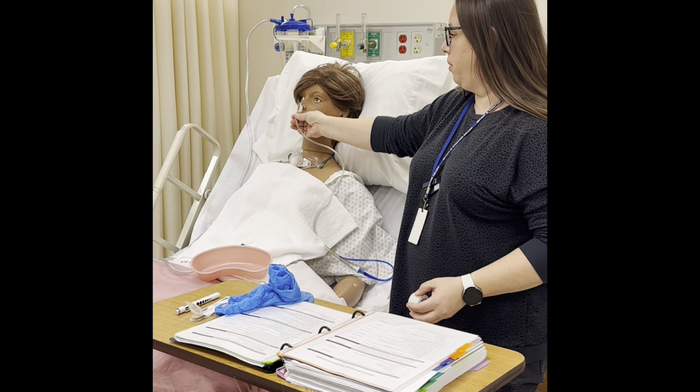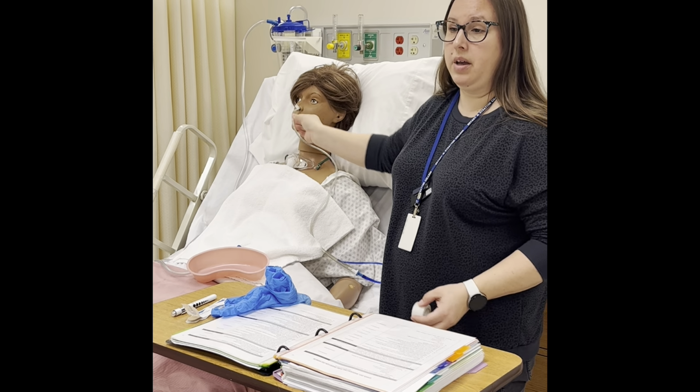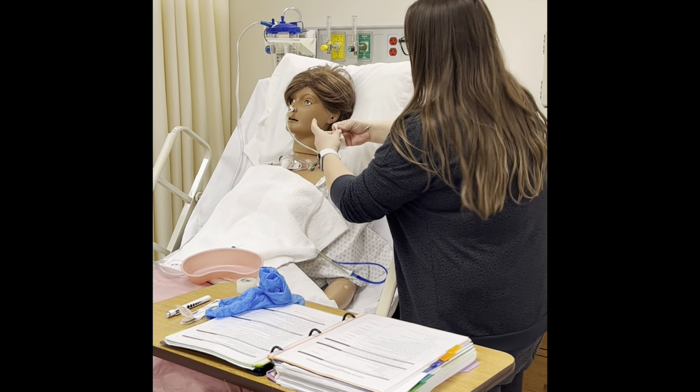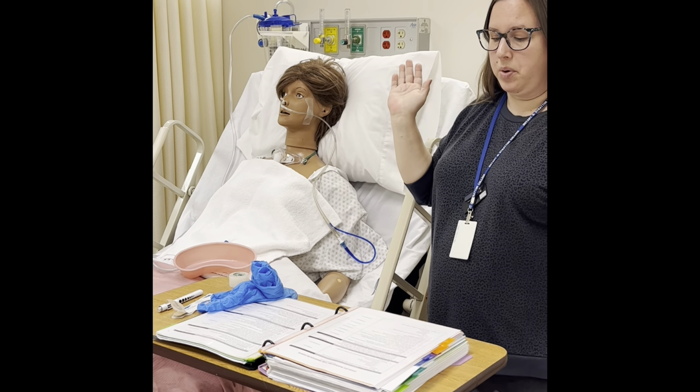We're going to temporarily anchor this because we need both of our hands. In real life, in a real person, this will start sliding out. It won't in her. But in real life, again, slippery on the inside, it will just start falling out. So, temporarily anchor it. Now we can use both of our hands.